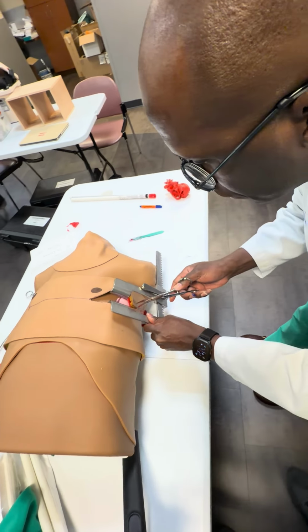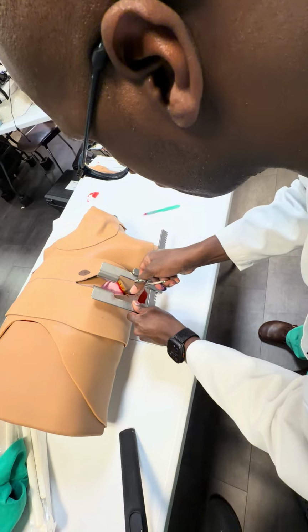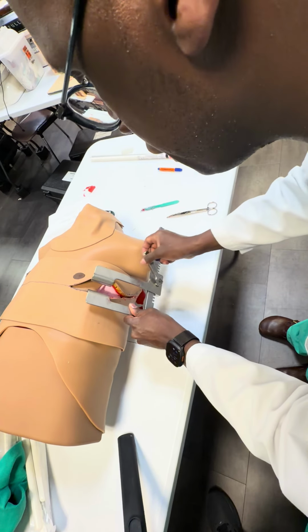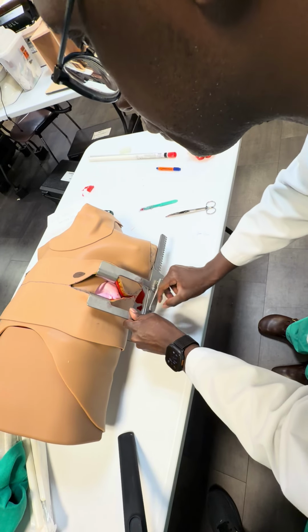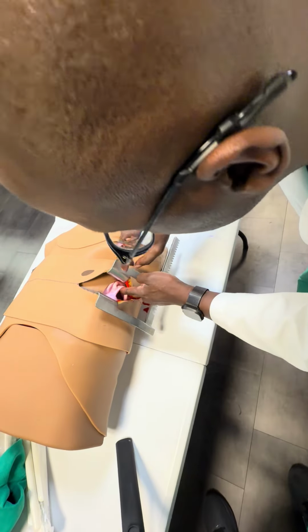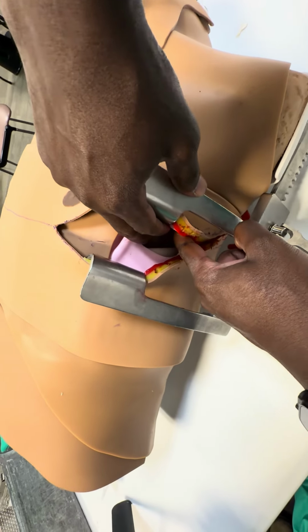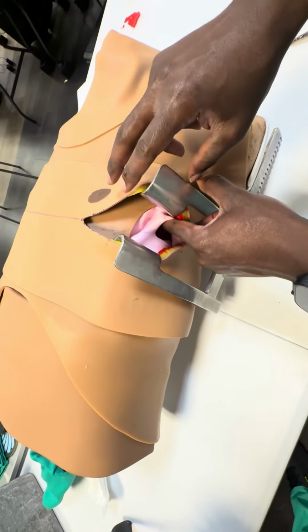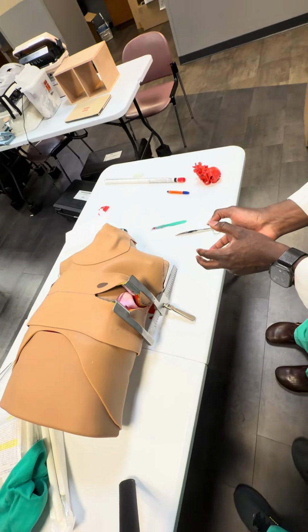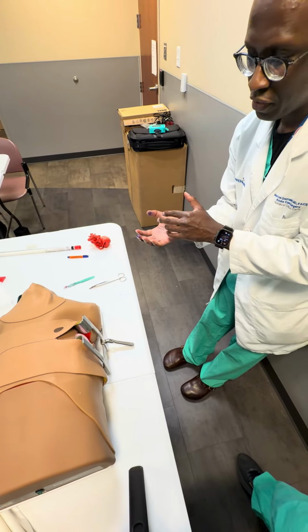Again, you can see right here that there was still some tissue left. I want to be very generous with my spreading. You can see the thoracic cavity in here. Now, this model doesn't go all the way into the cavity, but once I'm in the cavity and spread, you'll encounter the left lung.